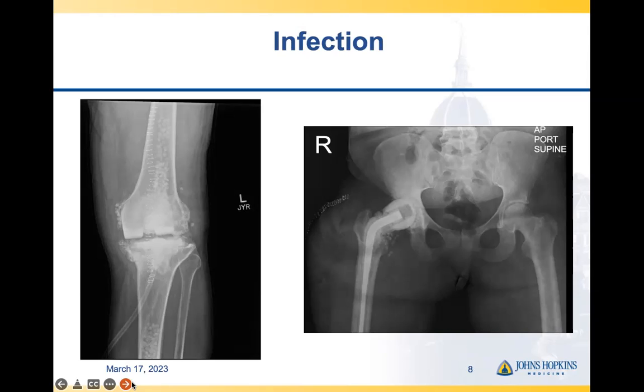Again, it's essential to remember that for the rest of your life, because these implants are not designed to fight infections on their own, you do need an intact immune system to fight that infection. With regards to the fractures that we just covered, the implants are very, very strong. These implants are typically made of metals such as titanium, and plastics, which are very high-grade polyethylene components. So the modern implant by itself doesn't really break into multiple pieces. If someone were to have a nasty fall on a hard surface on that joint that's replaced, typically I let patients know that the implant will not break, but the bone around the implant is at risk of breaking because there's a mismatch between the density of the implant and the density of the bone. The implant is more dense and more strong compared to the native bone.